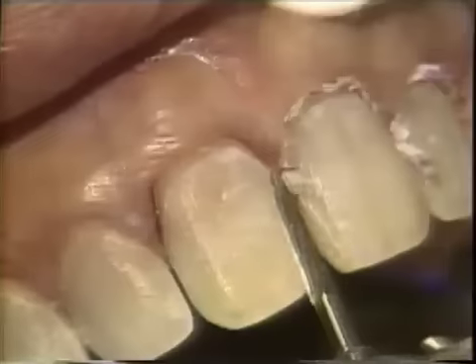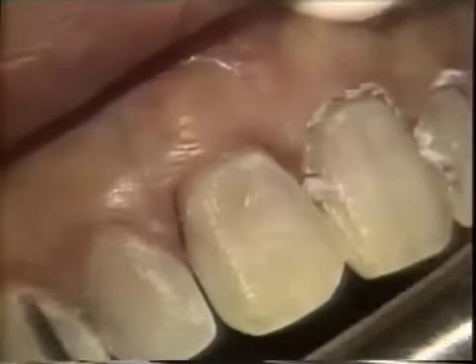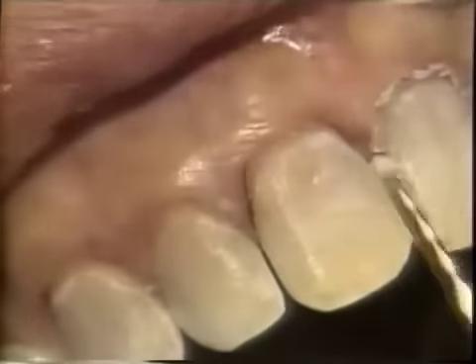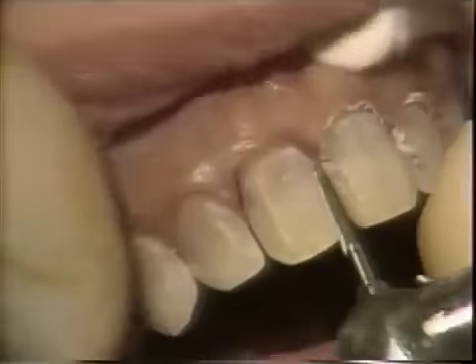Now you can see the area of enamel that we have exposed with our tissue pack, and now we're going to bring the finishing line up just a little bit farther.